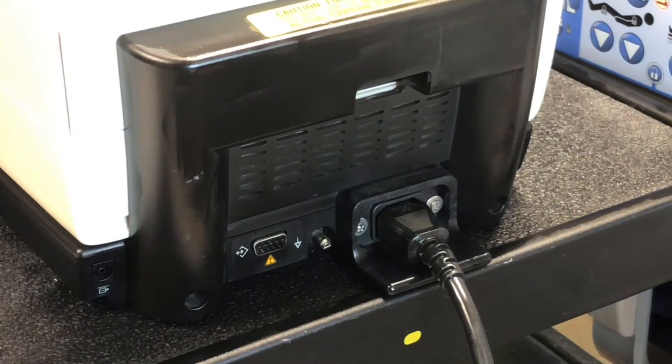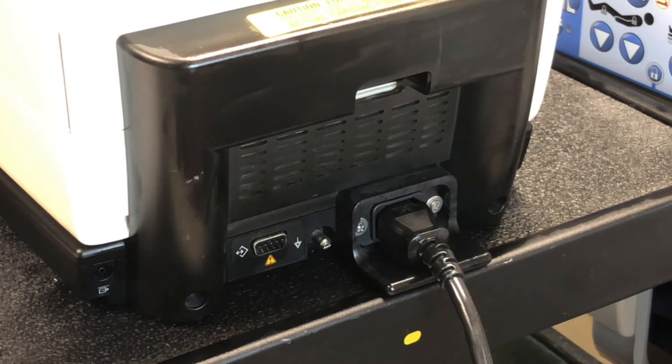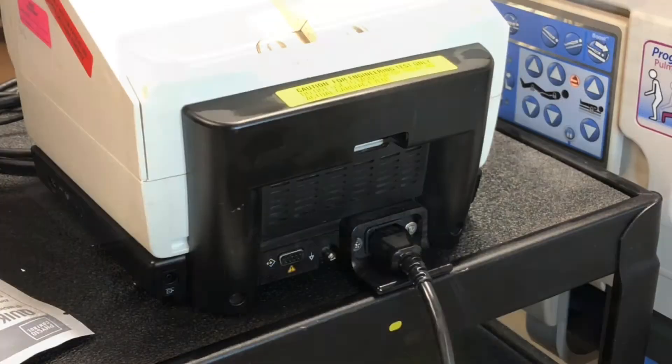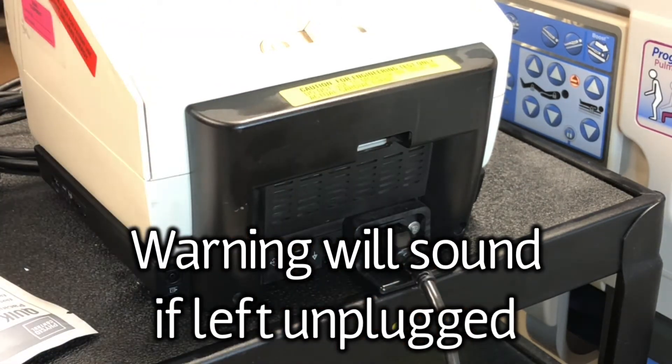A new fully charged battery provides about 90 360-joule discharges, 70 minutes of pacing, or about 120 minutes of continuous monitoring before the device powers off. When the power cable is disconnected, the LifePak 20E will give an audible alarm.